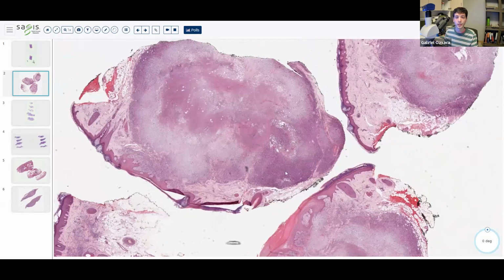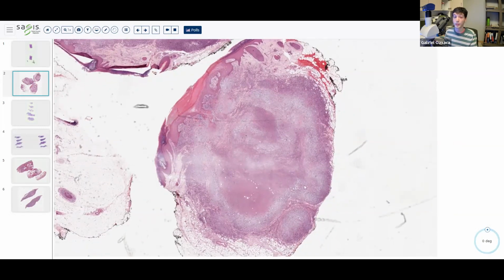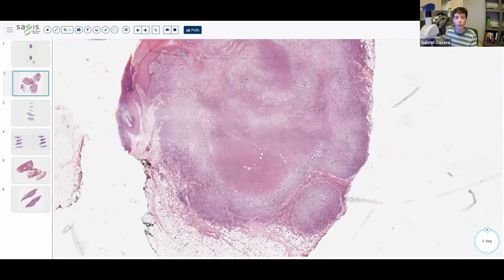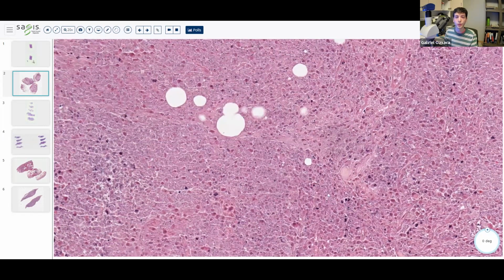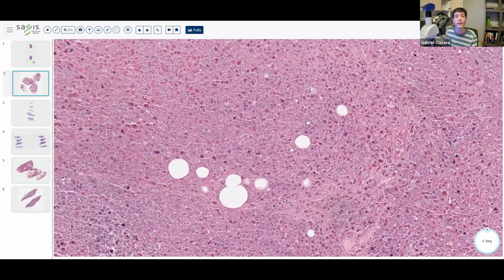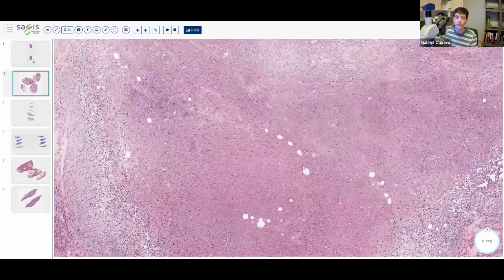And we see variation in the coloration of the lesion. Here it's more purple, here it's more white, here it's purple again. So let's find out what's going on within each of these zones. If we hone in on the central portion of the lesion, we have a whole heck of a lot of karyorectic debris and no actual cells that we can observe, at least any viable cells. So this is a large zone of geographic necrosis.